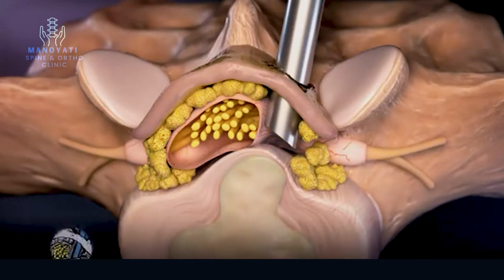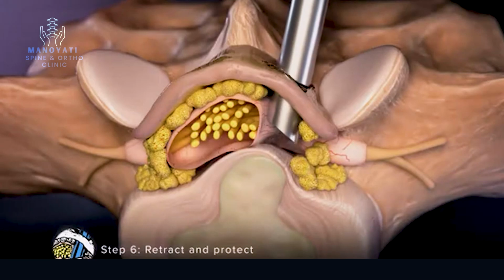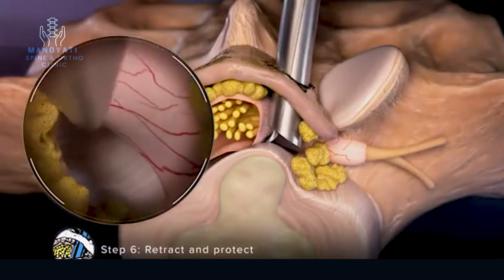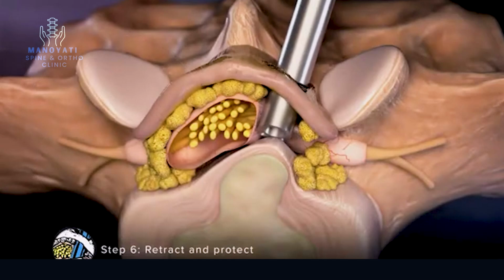Step 6. Retract and protect. Mobilize the nerve root by using instruments such as a blunt tip elevator, nerve hook, and articulating probe to release any scar tissue that may be adhered to the dura. Once the nerve root has been mobilized, advance and rotate the cannula to retract and protect the nerve root.